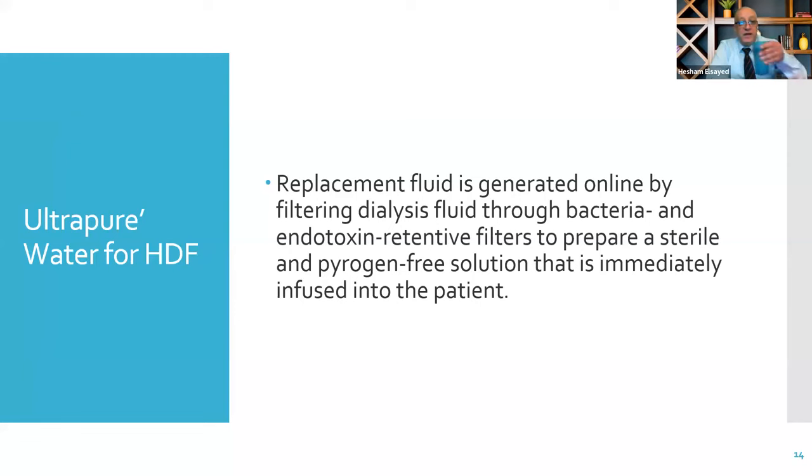Ultra-pure replacement fluid is generated online. That's the meaning of online, so we have no packs. We are generating the fluids online by filtering dialysis fluid through bacterial and endotoxin retention filters to prepare a sterile and pyrogen-free solution that is immediately infused into the patient.